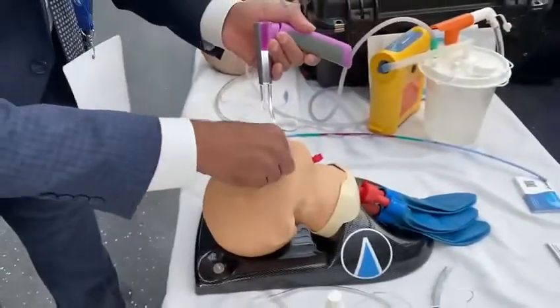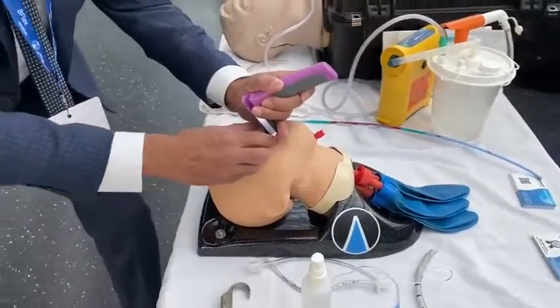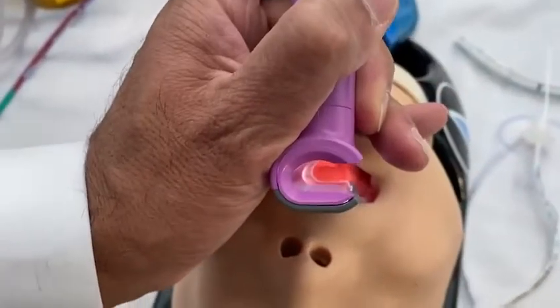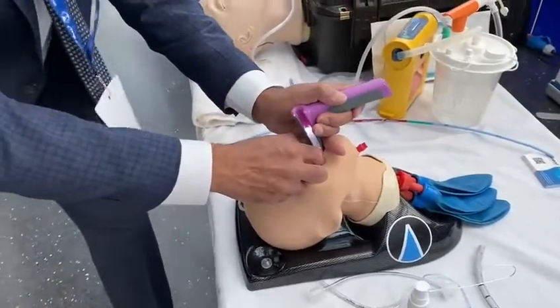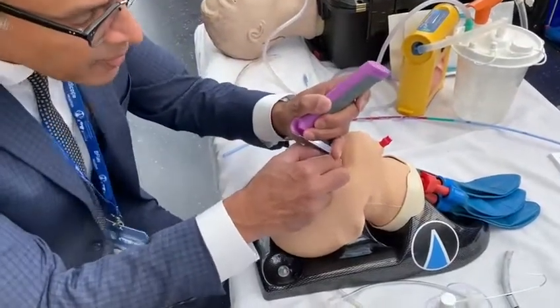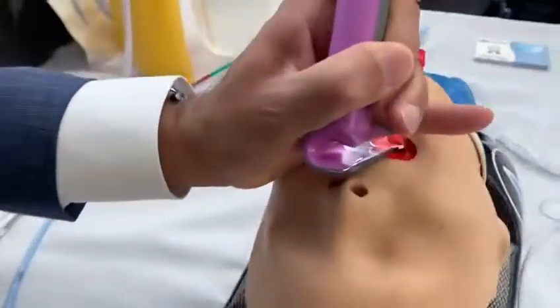In intubating, we'll use it with our left hand, open the mouth. I'm looking all the time and then I can see the epiglottis here. In this particular mannequin it's quite long, quite floppy, sort of retroflexes. So I'm going to hold it and pull it out of the way and see the cords.